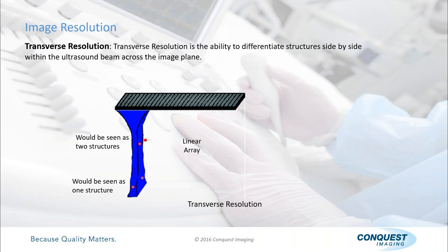Does that make sense? So yes, you can kind of use this Phantom for 3D imaging and do a measurement, but a lot of the probes won't fit in this gap. So it's really how you use it and what you're using it for. Okay.